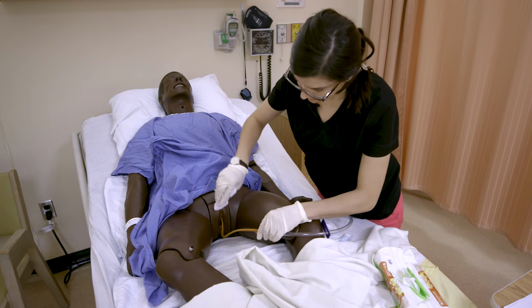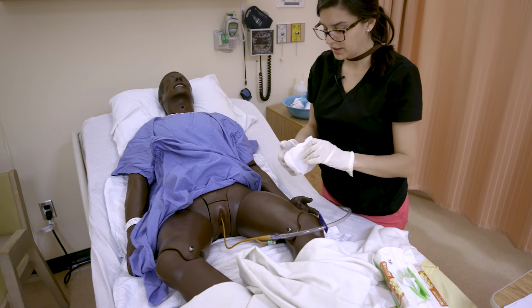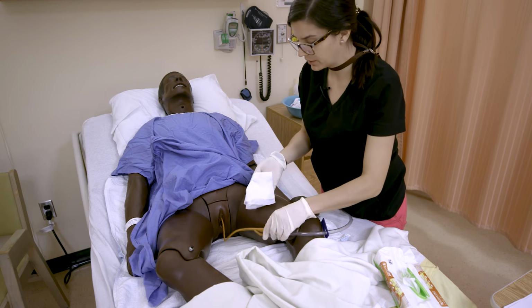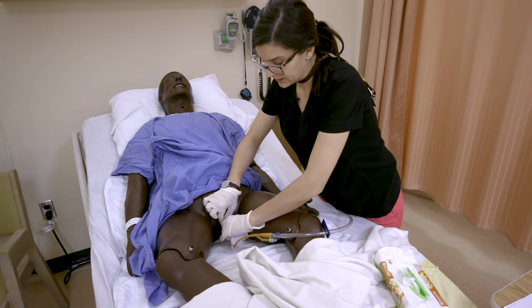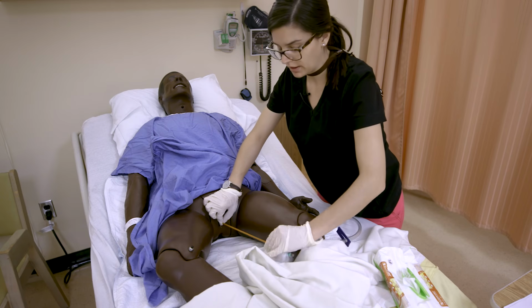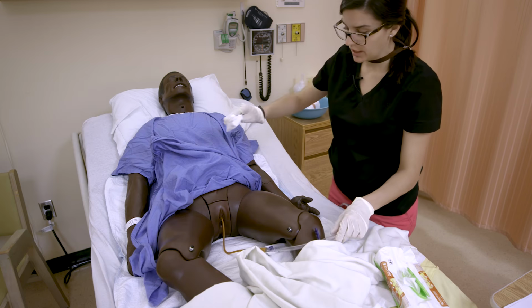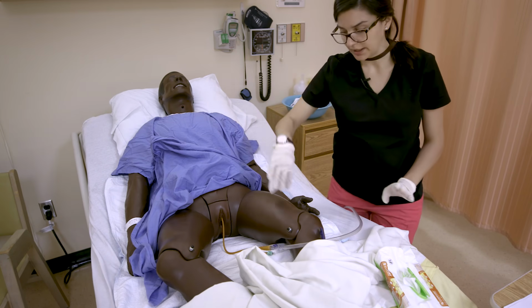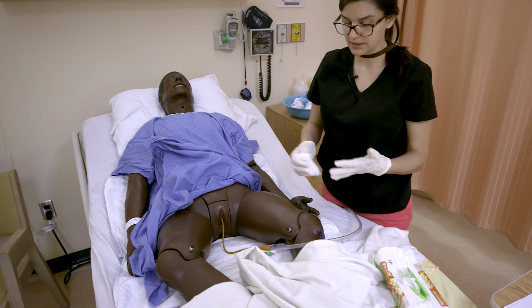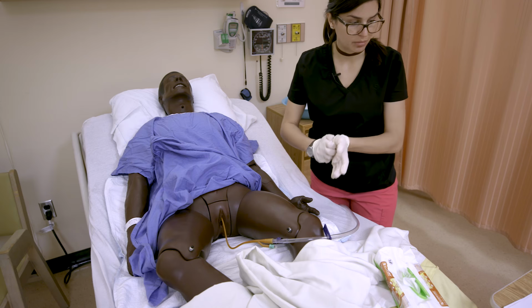And we're going to do that throughout in the center. Again, new cloth or a new portion of the cloth. And we're going to actually stabilize here and clean the catheter tubing if it became contaminated with anything. So again, moving in that direction away from the patient, so you're not bringing any contaminants up towards the patient's urethra and eventually into their sterile bladder.